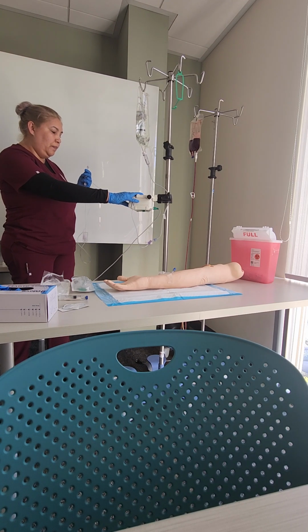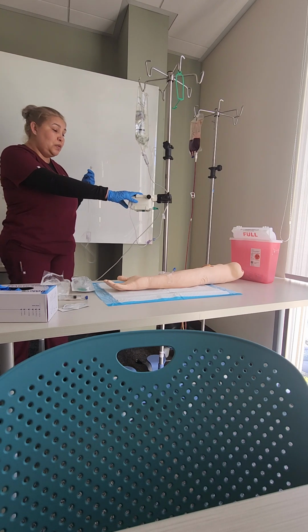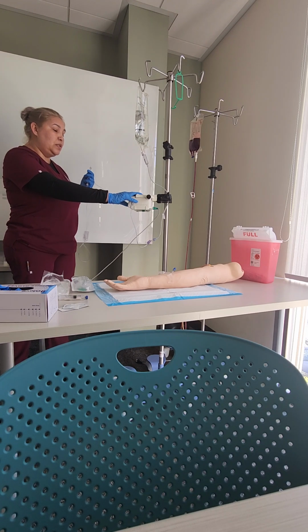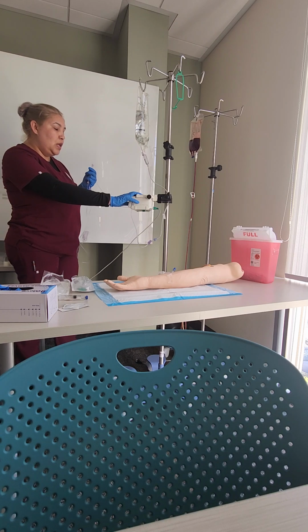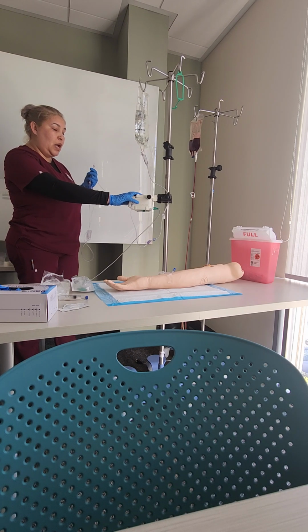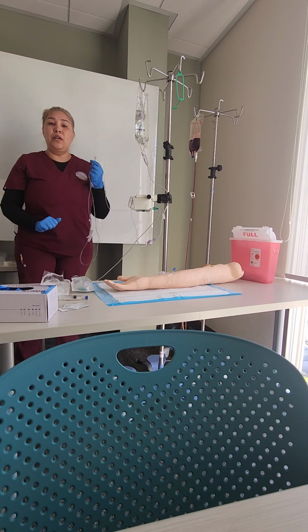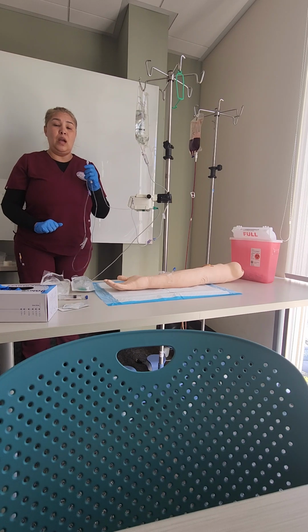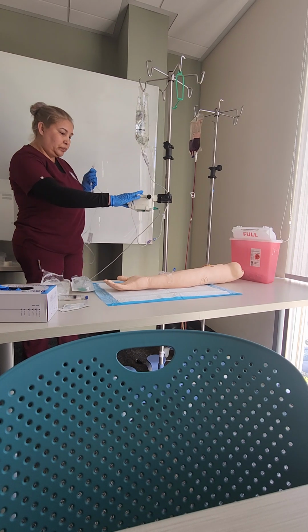Okay, say okay. And now it's going to ask me for the volume to be infused. My bag is 1,000 mLs, but I want to do 900 mLs. The reason for that is because I want to make sure that the alarm is going to go off prior to the bag being empty. I never want to leave the line without anything.